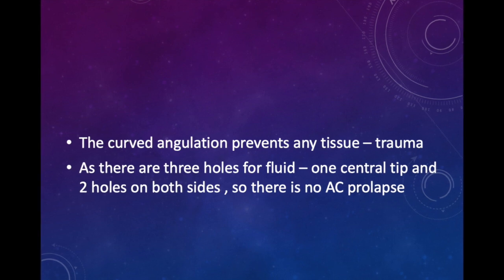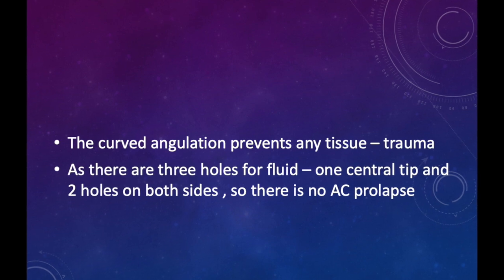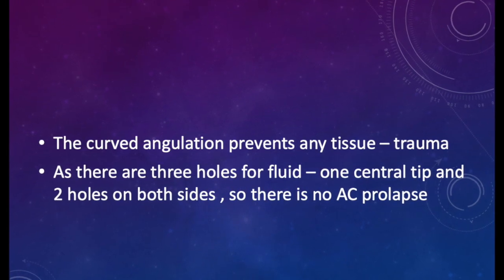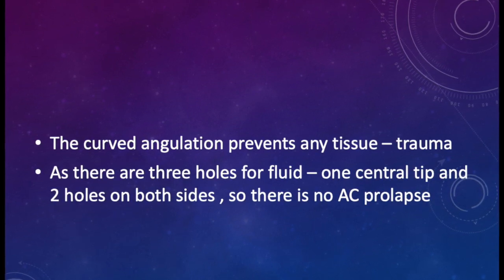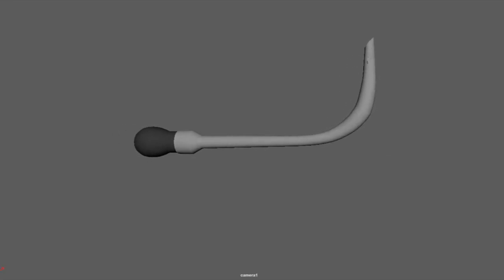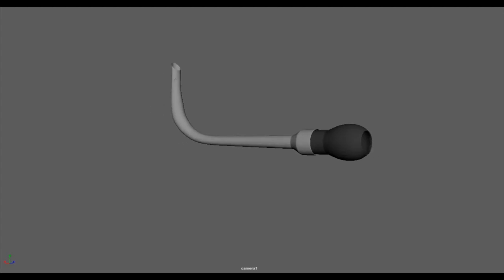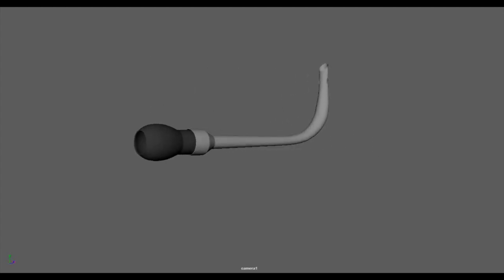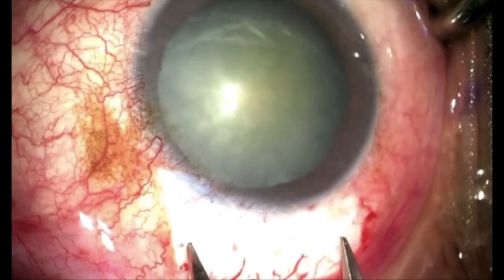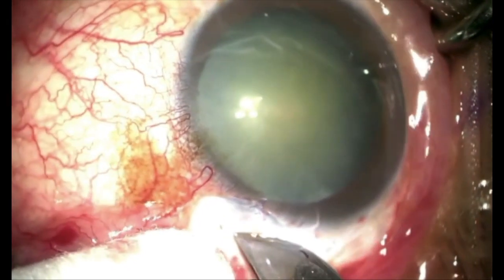The curved angulation prevents any tissue trauma, and as there are 3 holes for fluid, 1 central tip and 2 holes on either side, there is no anterior chamber prolapse. This is the design of Morya's 3-way hydrocannula with a beveled up central opening of 0.7 mm and 2 side openings of 0.3 mm. This video is showing Morya's technique of nucleus hydroexpression.